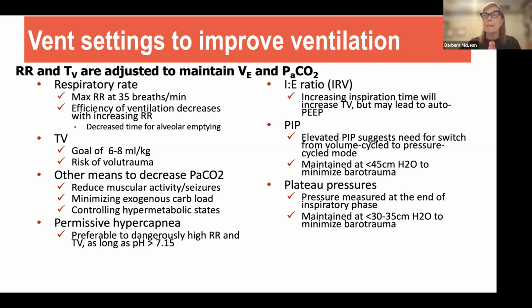So always really important. We also talk about tidal volume. Respiratory rate times tidal volume gives us minute ventilation. Typically, in today's world, we like to set the tidal volume at 6 to 8 mLs per kg of predicted body weight. And you'll remember I've talked about predicted body weight before, that it's not really about how much the patient weighs. It is about their gender and their height, which determines the size of the thoracic cage. And remember, when you are breathing at higher tidal volumes, 8, 9, 10, you run the risk of overdistension of the alveoli and risk of volutrauma.